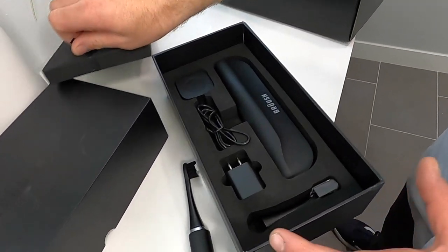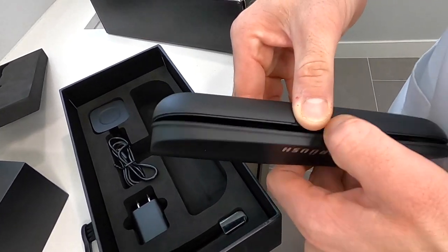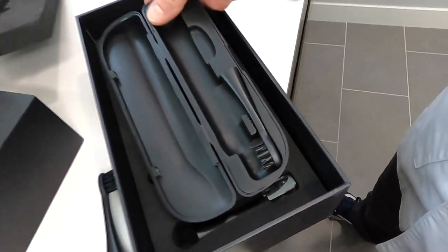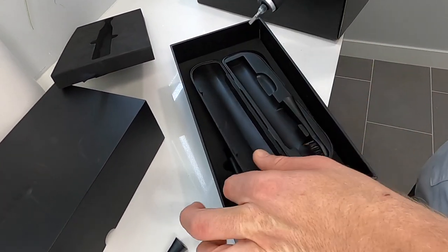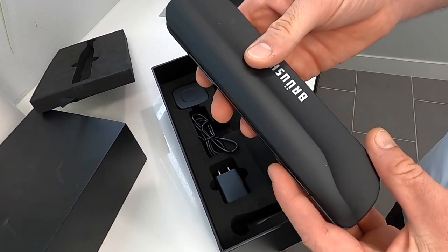Along with it, you get a travel case, which is really nice, so that your toothbrush isn't all over your other luggage. It holds a brush head separately, so all you have to do is put it in here while you travel. Put that in your toiletry bag and you're good to go.